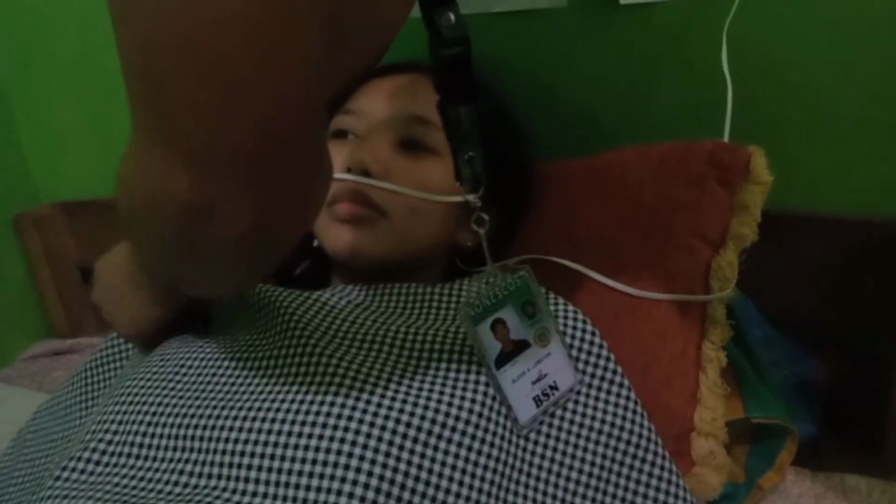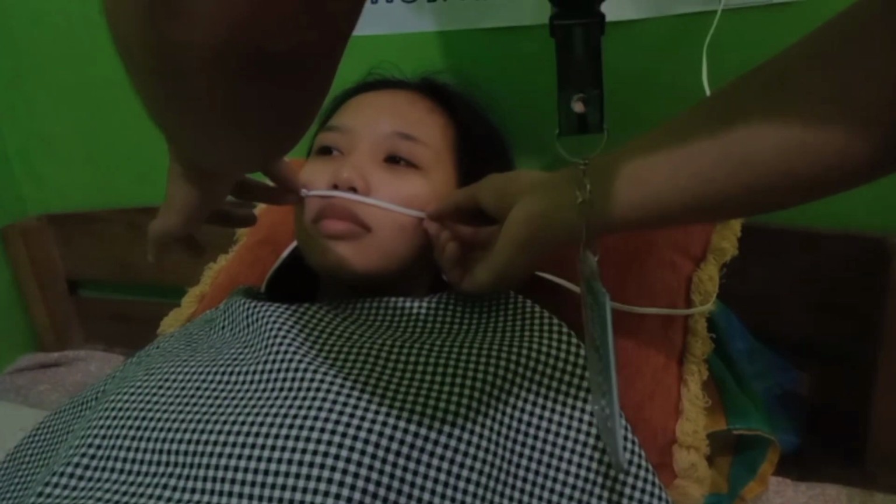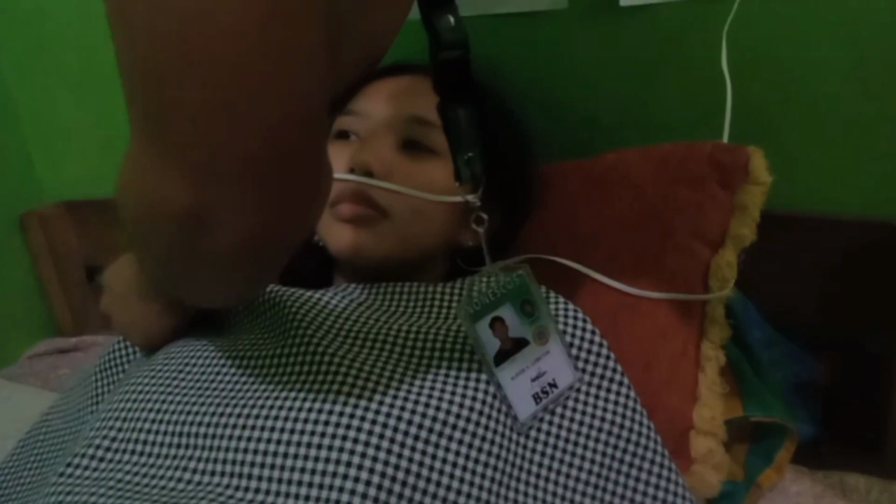Take note that the cannula permits some freedom of movement and does not interfere with the client's ability to eat or talk. If prongs dislodge from nares, replace promptly to ensure correct oxygen delivery and prevent hypoxemia.